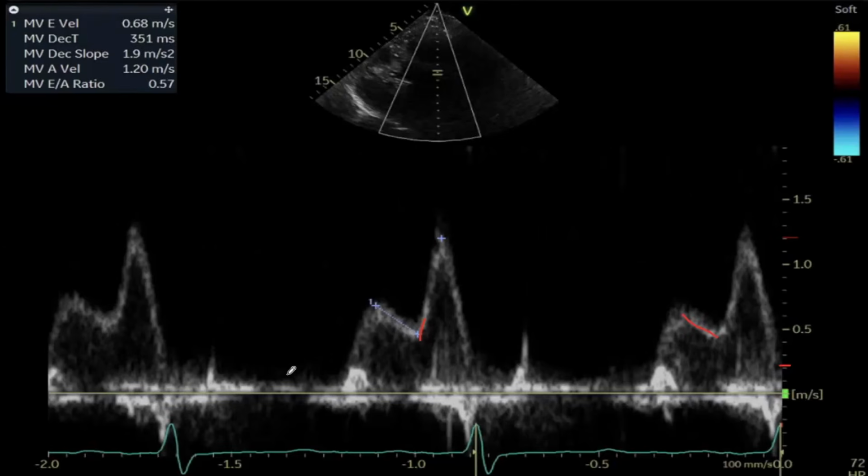That's why I remember I used to hear that they used to have more than 14 items to check whether the patient is grade 1, grade 2 or grade 3. Then they summarized it into these tables just to make it user friendly for everyone. These are supportive measures rather than diagnostic things. And you should put the whole patient together.